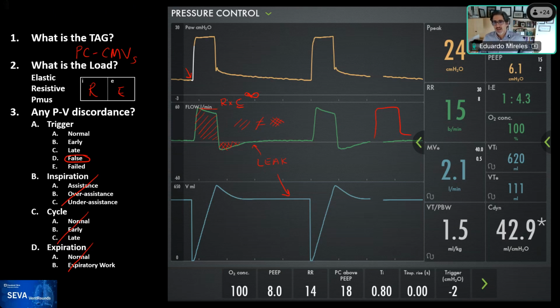Evidently, and perhaps from Ariel, I will give a little bit of context: this patient had a large central airway obstruction for which an ET tube was placed that had to be very small, but because the patient is large, the cuff doesn't occlude the airway. So you pass an ET tube through a very narrow opening, and you're below that, you cannot pass a larger tube. So the cuff discrepancy with the trachea is huge. So you have this massive leak on this patient. So how do we deal with it?